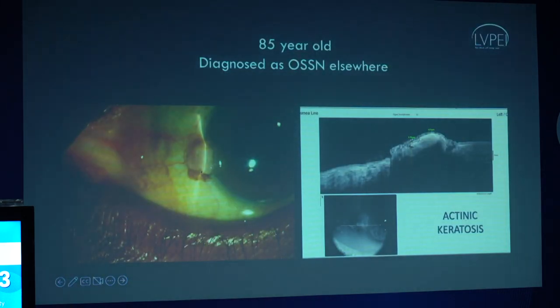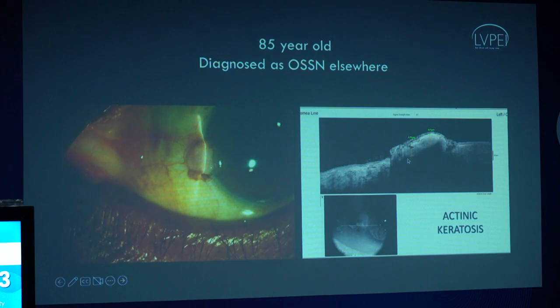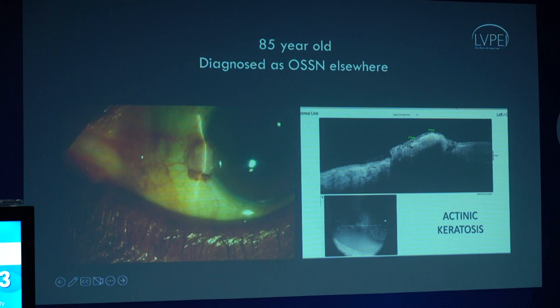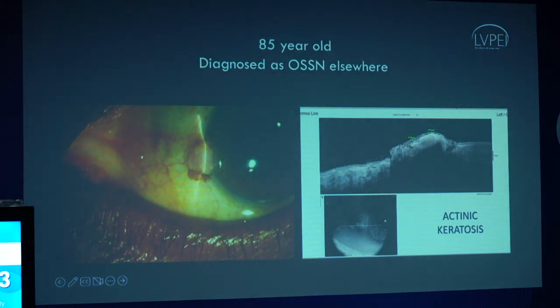Contrast this with the clinical image of an 85-year-old male who was diagnosed as OSSN elsewhere. If you look at this OCT carefully, you will see that although there is some undulation, there is no hyperreflectivity nor is there transition of the epithelium from the adjacent cornea. So this patient was ultimately a case of actinic keratosis.